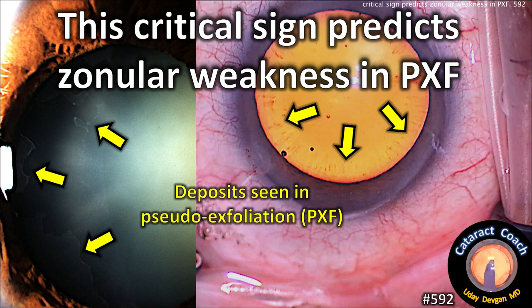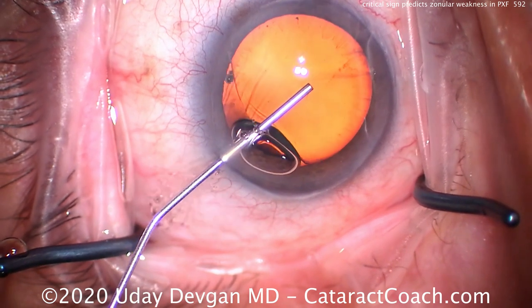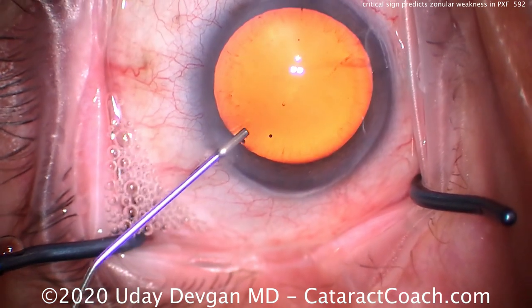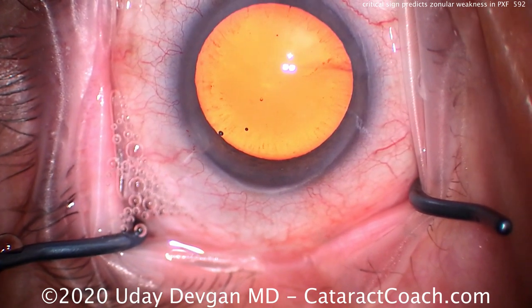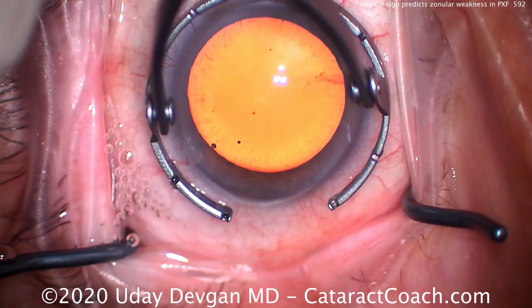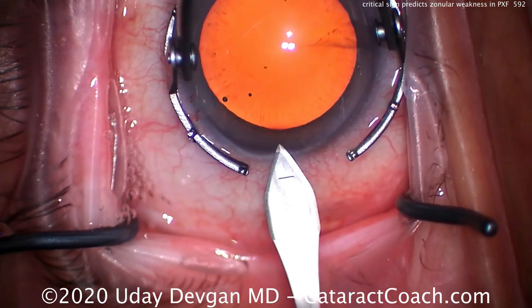cataractcoach.com — this critical sign predicts zonular weakness in pseudoexfoliation. Here we can see these fibrillar deposits at the peripheral pupil margin and the edge of the lens, very characteristic of pseudoexfoliation. We'll make our main incision here.